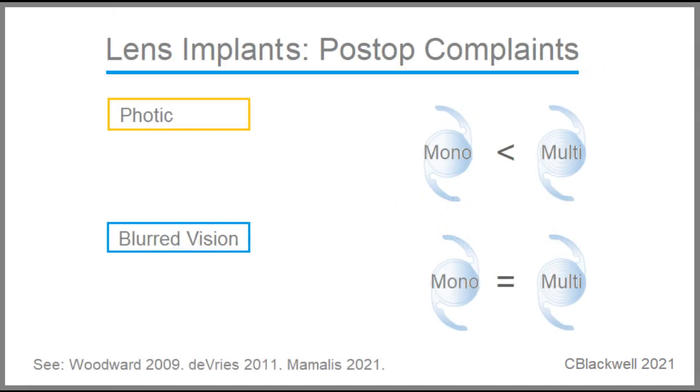Staying with this subject for another minute. Patient complaints after cataract surgery generally fall into 2 categories: blurred vision and distracting visual phenomena. We have just covered glare and halos, so let's talk about blurred vision. First, refraction issues. After surgery, there can be some remaining amount of uncorrected refractive error. Calculation of lens implant power has gotten very good, but it's not perfect. One estimate is that 3/4 of surgeries end up within half a diopter of their target. Pretty good.